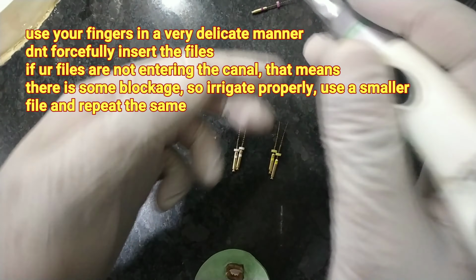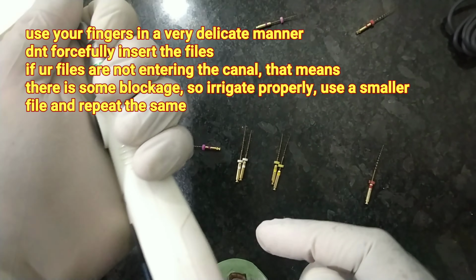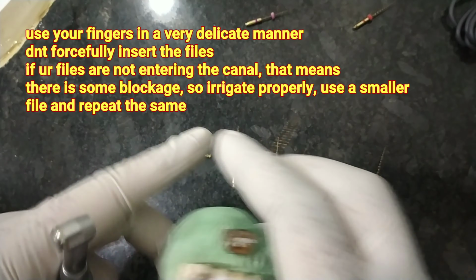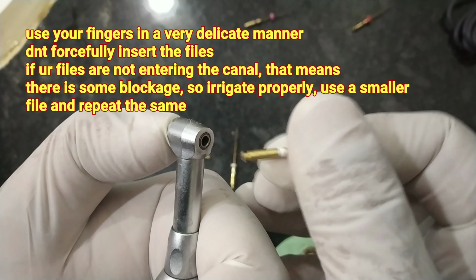Similarly, whatever file I have used initially, after this I have to irrigate, and then I use the number 15 file. Again I have to fit it like this.